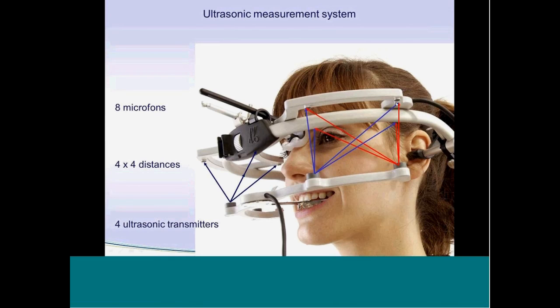That means from every transmitter we can get 4 different distances. From the traveling time we can calculate the distance. That means 4 distances here, 4 here, and 8 on the other side. That makes 16 different distances to get information about the position of the lower bow in relation to the upper one. And these measurements will be done 50 times per second, and therefore we can follow these movements in a very precise way.